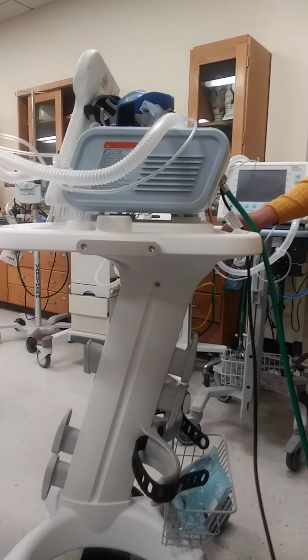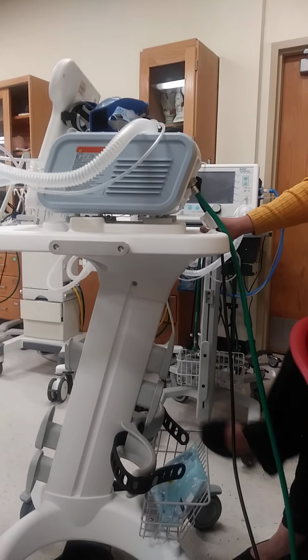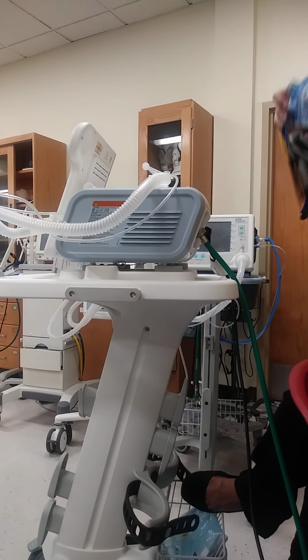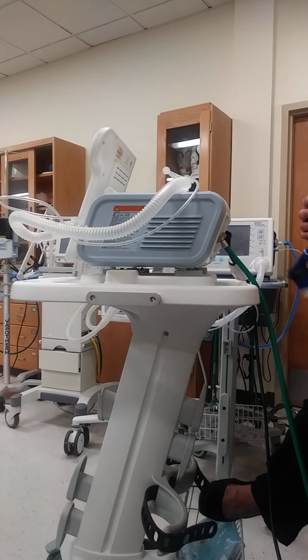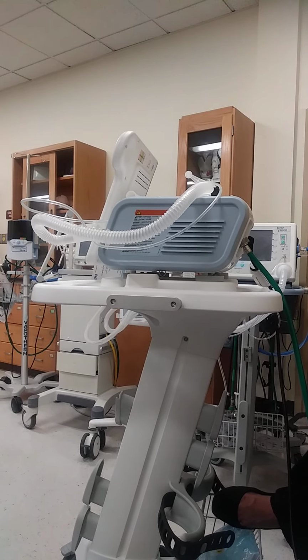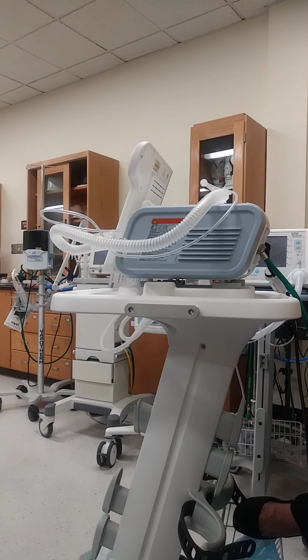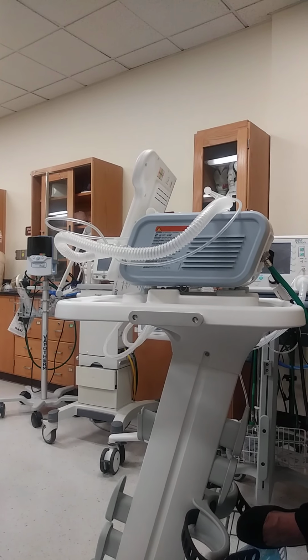Okay, so let me give you guys a scenario. I have an old patient who has dementia and is having trouble breathing, has a really bad pneumonia. When I explained to him how to take off the mask, he didn't understand. Would I put him on a BiPAP? No. Okay. I have a COVID pneumonia patient who is breathing 40 breaths per minute, hypoxic, so low SpO2, and high flow's not doing much for them. Would he be a good candidate for the BiPAP?